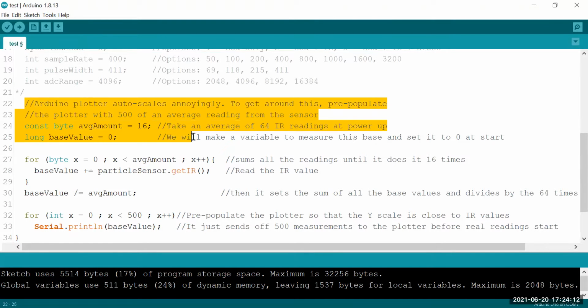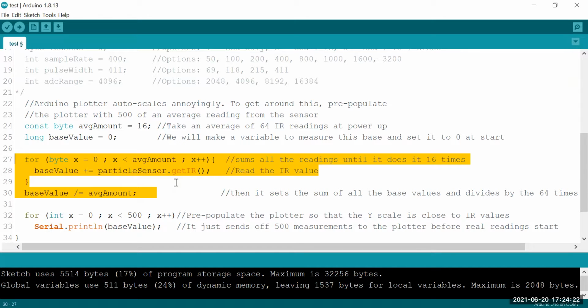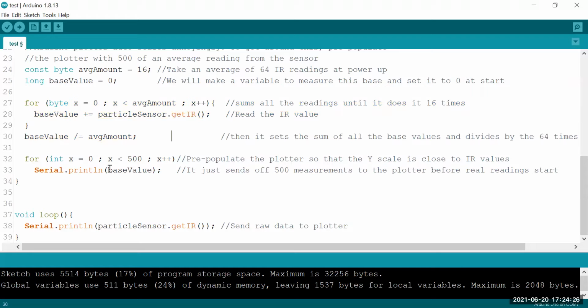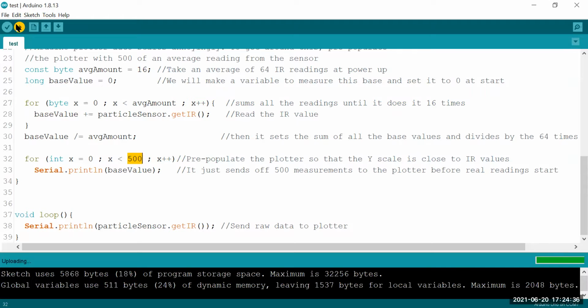Again, it is saying, okay, I'm going to take 16 measurements. I'm going to measure 16 times, add them together, and divide by 16. This is taking the average. Then I'm going to take the average and print it on the serial plotter 500 times, and that's just to clear the serial plotter out so that it starts scaled to the values that your finger actually is reflecting into the sensor. I hope that helped.